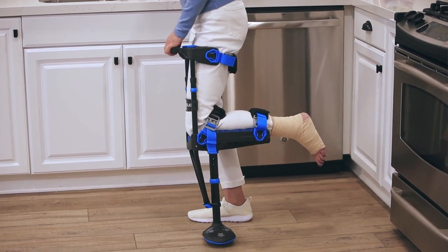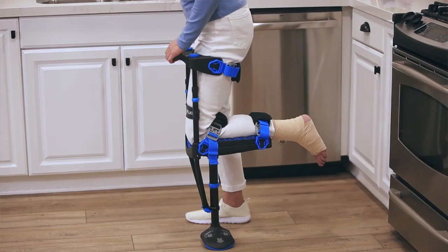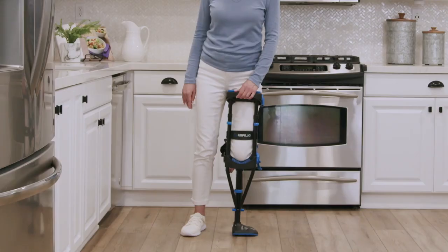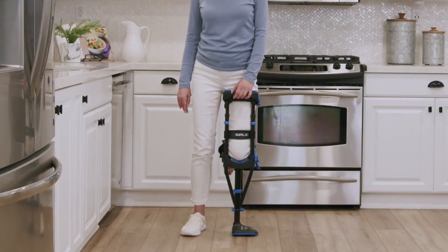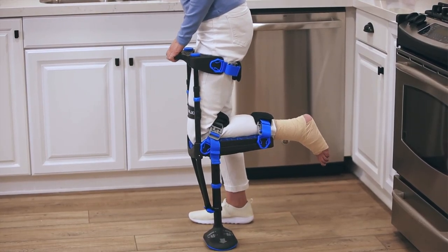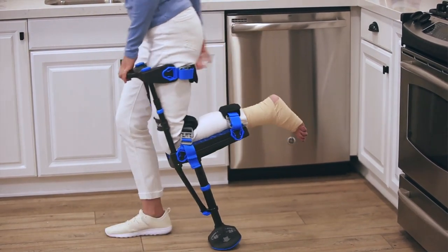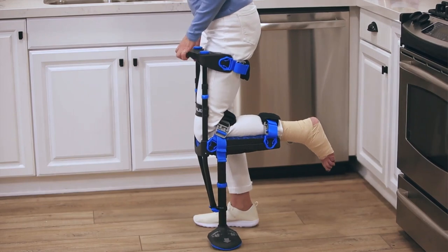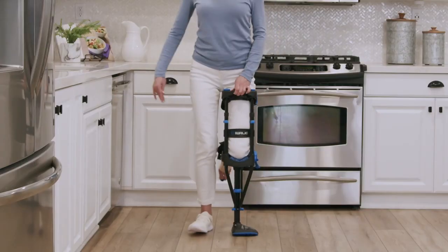Before you walk, we're going to do a couple of practice exercises. Place your hand on the handle. Lean slightly toward the iWALK side and shift most of your weight onto the iWALK. Then slowly lean forward and when it feels natural, take a half step forward with your good leg. Try to keep your back straight and don't bend at the waist. Put most of your weight on the iWALK leg and step back to return to the starting position.